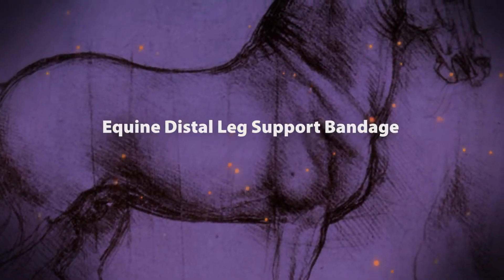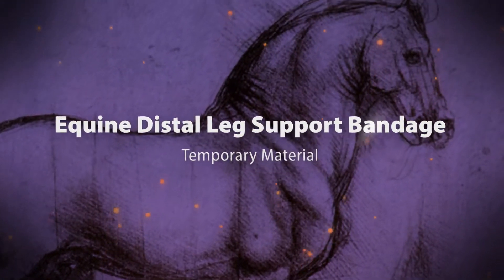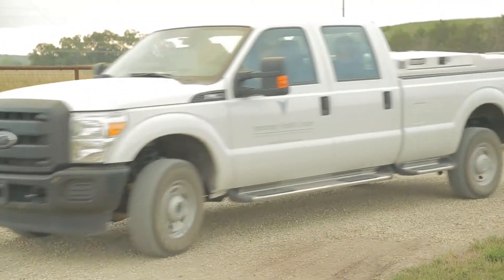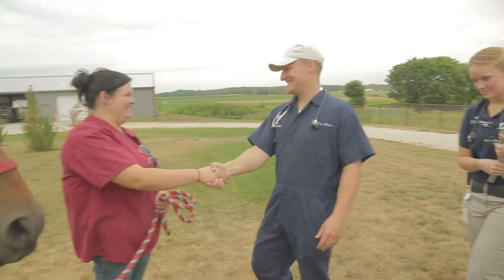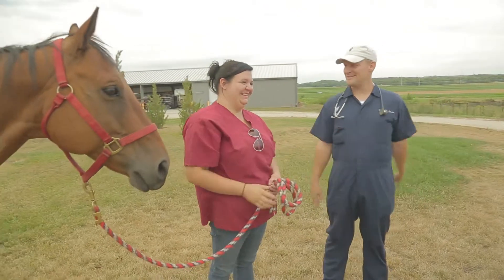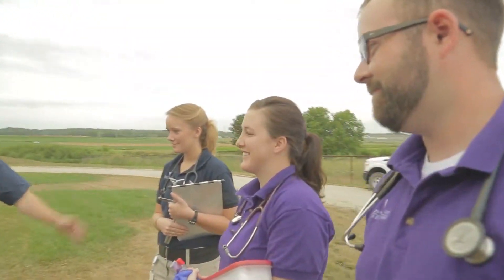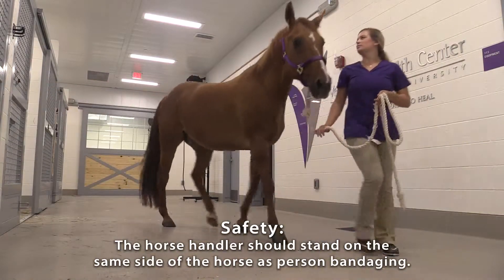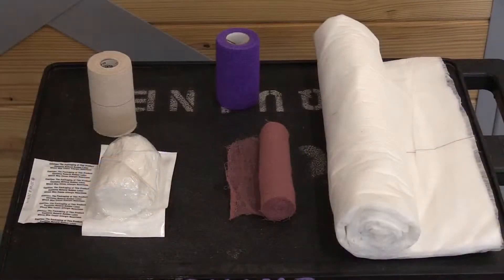Hello, I'm Dr. Chris Blevins here at Kansas State University Veterinary Health Center. I am the equine field service clinician here at the university. We take students out on farm calls and do general equine work. One of the most common things that we do to horses is place a bandage on their leg for multiple purposes — one is for support, the other is for wounds or inflammation and to get edema out of the leg.